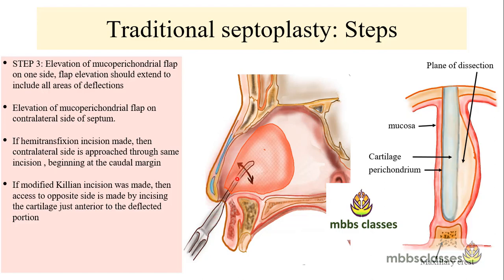The flap is elevated using the Freer's elevator. The dissection continues in the submucoperichondrial plane, and flap elevation extends to include all areas of deflection until we reach the bone and cartilage junction. After reaching the bone-cartilage junction, the cartilage is separated from the posteriorly present bone, and dissection then begins in the subperiosteal plane — that is, below the periosteum in the bony part of the septum.